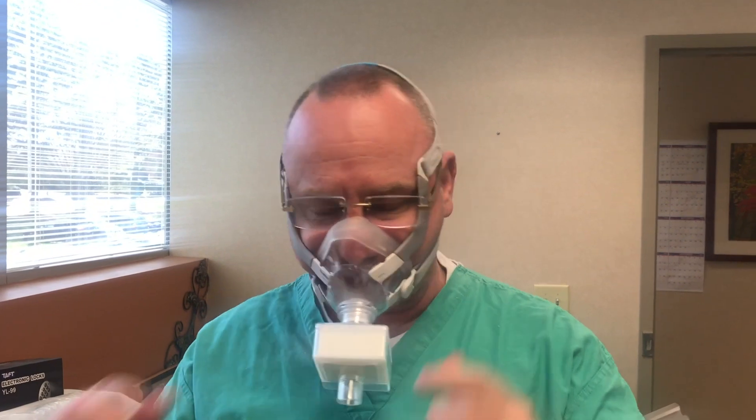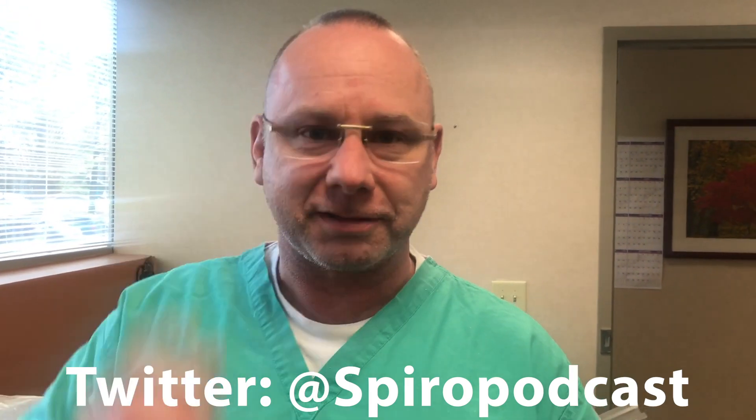When you're done with it, all you have to do is take this off and throw it in the trash. I probably won't — what I'll do is take all the gear off, then take this off separately. Since it is dishwasher safe, I'll just throw that in the dishwasher. Or maybe while I'm in the hospital, I have a bucket of bleach water and I'll just dunk the whole thing in — and now it's sterile once it dries. Just an idea — see what you think, open for comments or questions. Thanks.